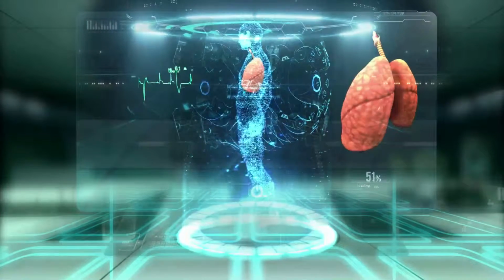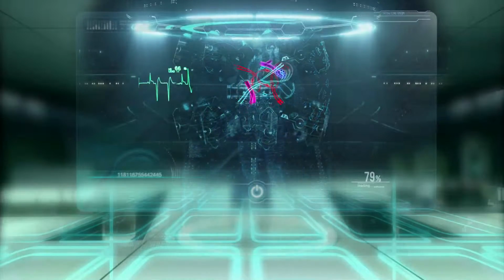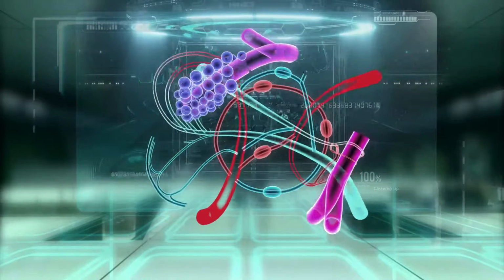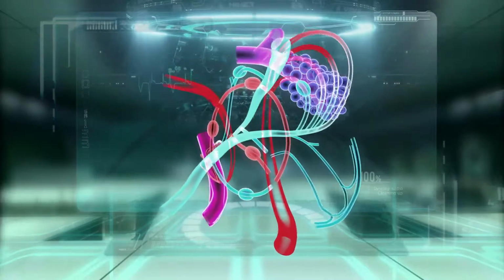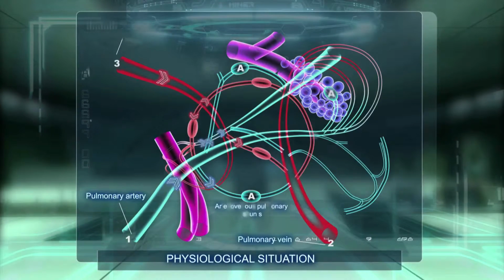The purpose of this methodology is to obtain a white infarction in the ventilated lung tissue surrounding the tumor, so that it will be possible to achieve a large safety margin and a homogeneous tumor necrosis. For this reason, we remember the different shunts which work in the lung.